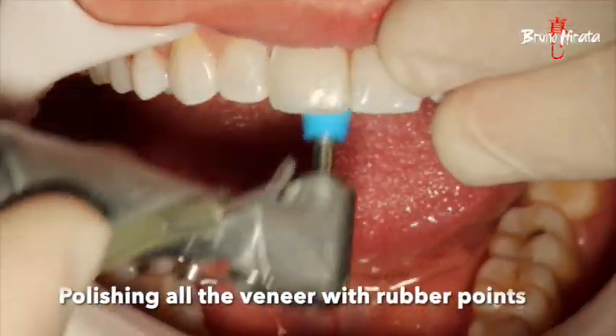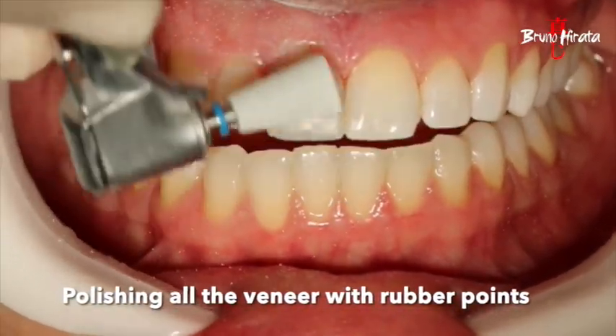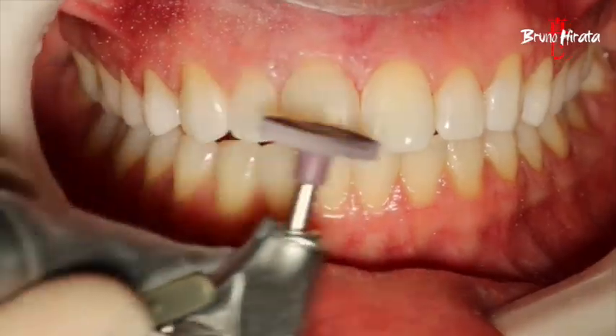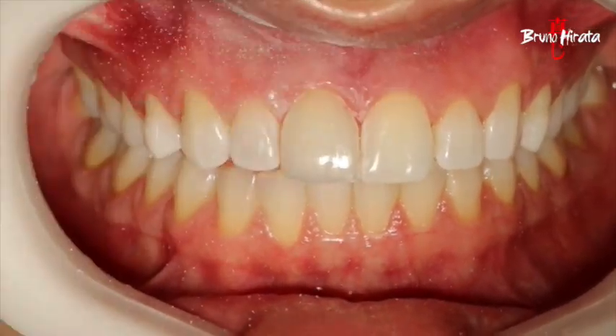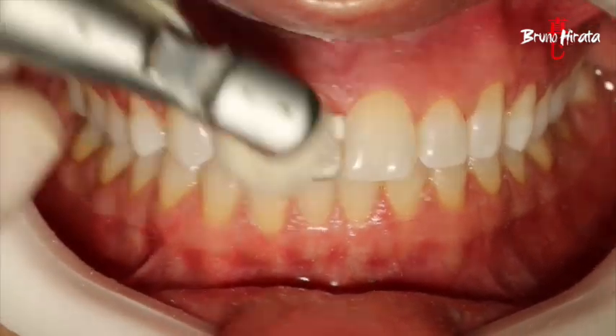The polishing was executed using rubber rotaries with varying levels of abrasiveness, followed by brushes, aluminum oxide polishing pastes, and buffing instruments.